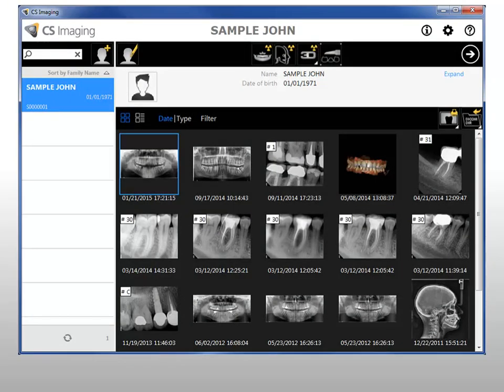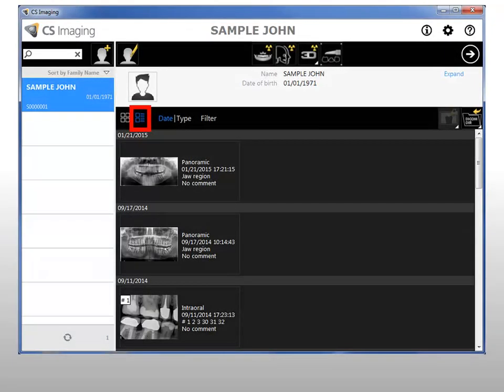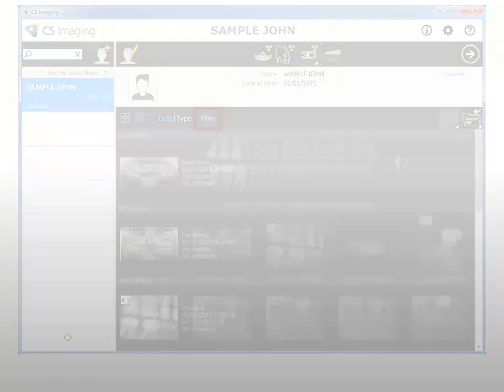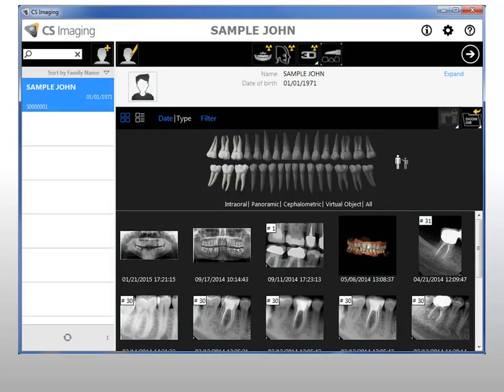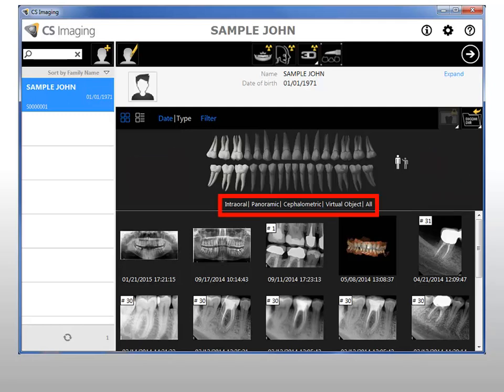The patient history displays thumbnails of all images for the selected patient. Using the patient history toolbar, you can view images as thumbnails, as a list, in date order, by image type, and using the dental arch filter. The dental arch filter allows you to view images by tooth number, dentition, and type.